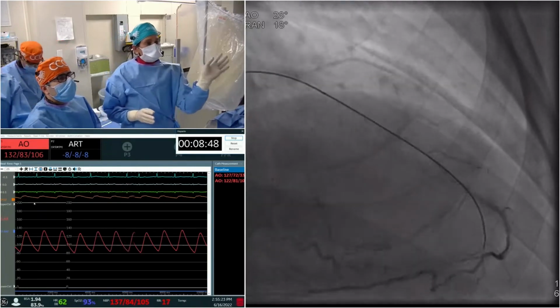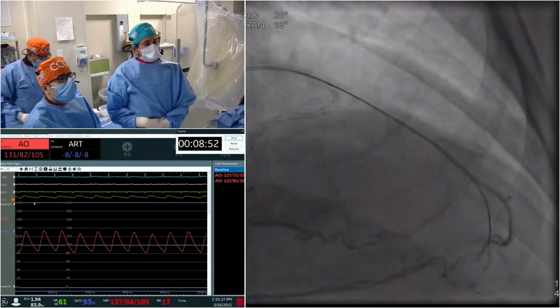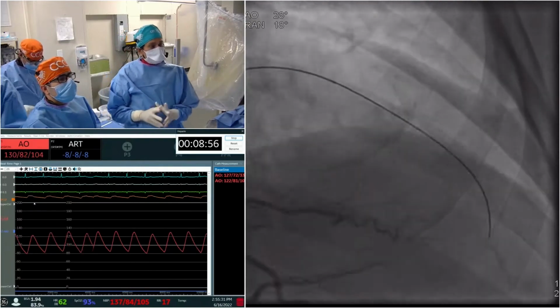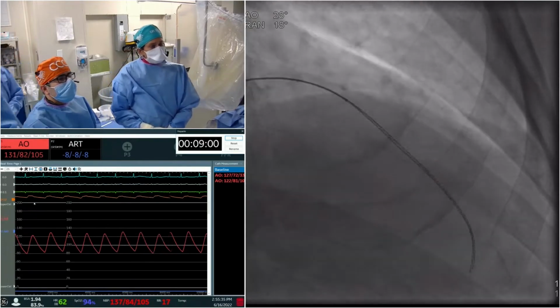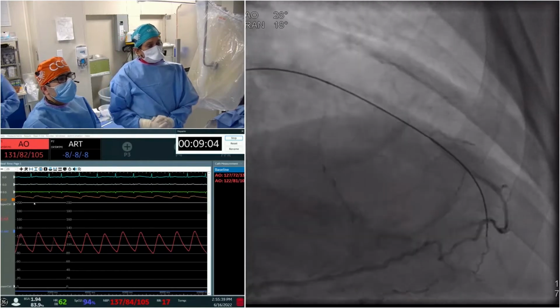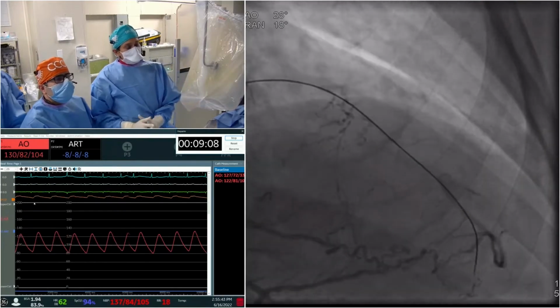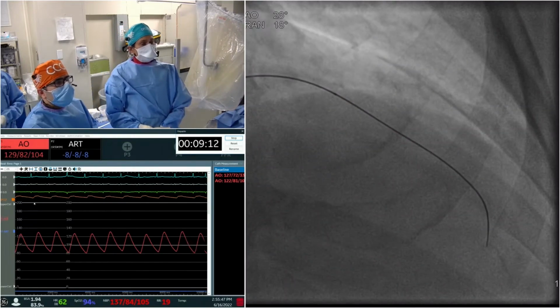I hope they're showing our app slides on the side, where we have a library of over 130 coronary guide wires, and we discuss every wire, the property of every wire. As interventional cardiologists, it's good to know which wire works in which situation. We also have over 20 complex cases showcasing which wire to be used where.